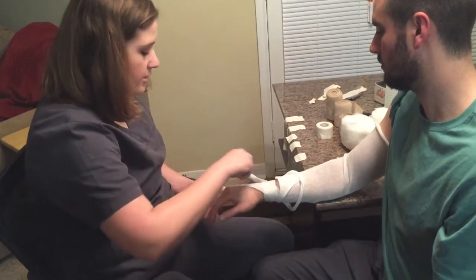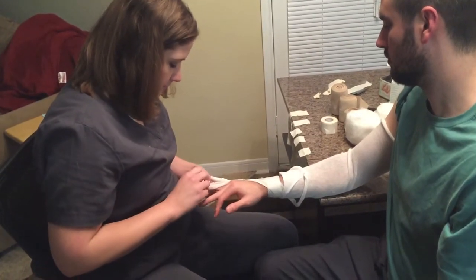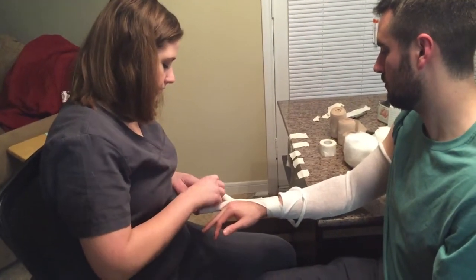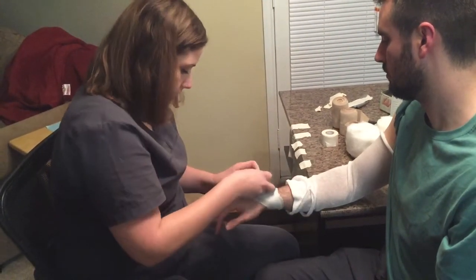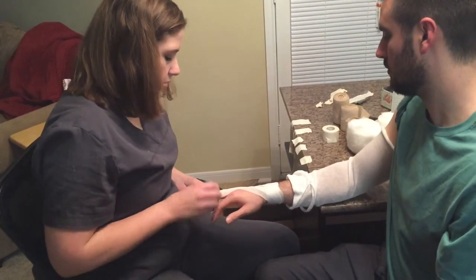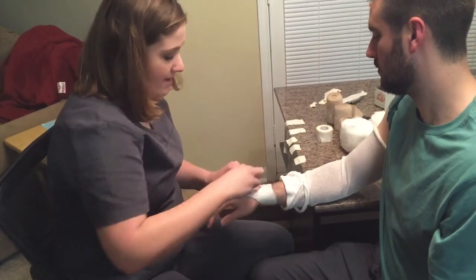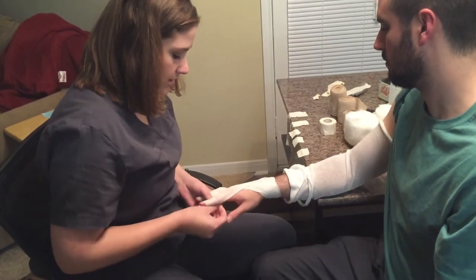Do you see how I just wrapped it back around your arm like that? The goal of this is not to get it really, really tight — you just want to wrap it. You want to make sure when you're doing this, you're keeping your palm clear so that you can still use your hand to pick up and carry things. Even though you're wearing this, I want you to keep using this hand, but don't lift anything heavy. A gallon of milk weighs about eight pounds — that's about the most I want you to lift.